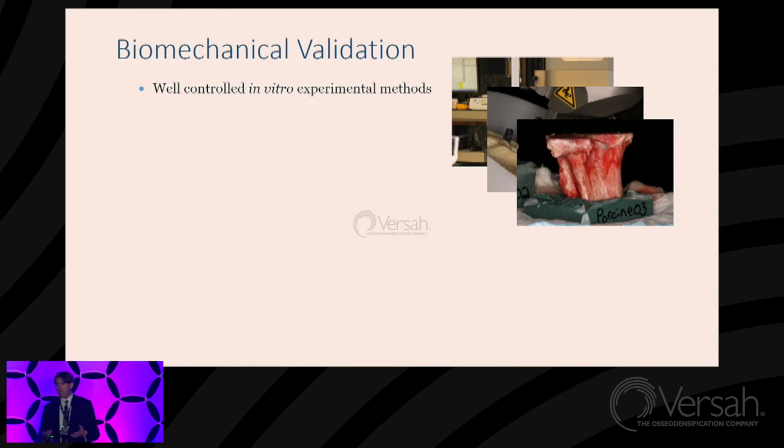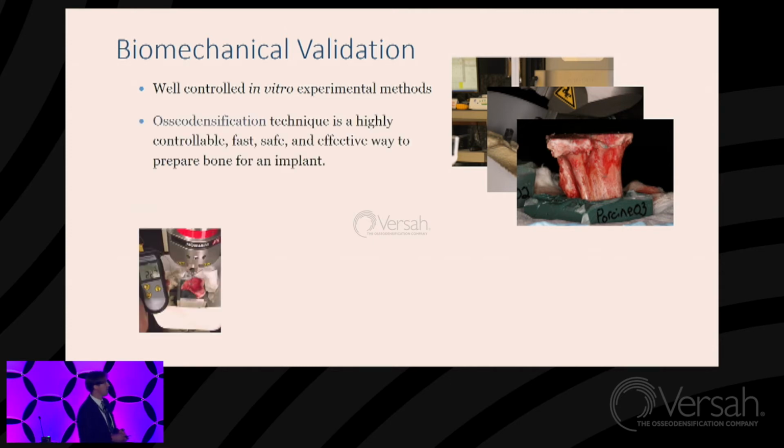And we needed a model of our tissue that allowed us to do repeated testing on different groups with limited variables in terms of the bone density across the surface and not the complex geometry that you would have in the mandible or maxilla. So we selected pig tibias, the proximal tibia, and we removed the cartilage and subchondral bone to expose the trabecular bone. So it was a fairly uniform and homogeneous type of tissue.